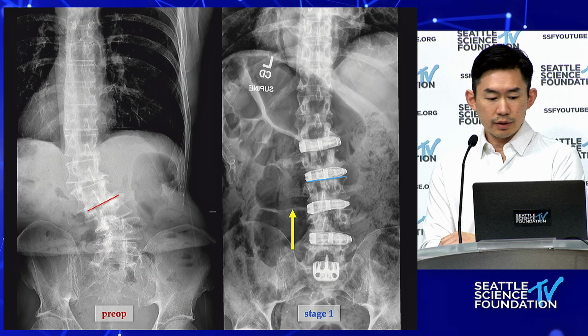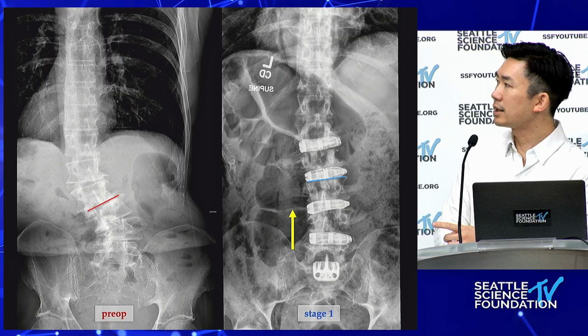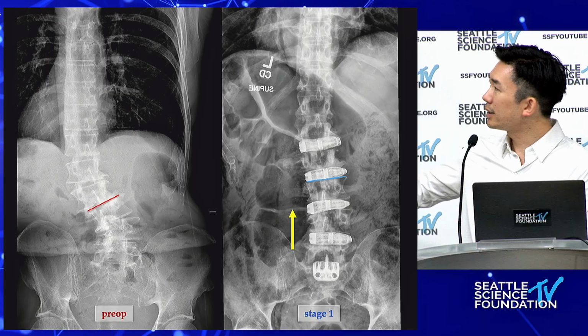I haven't used the coronal tapers, but I've had some inclinations toward it. Yeah, I guess in a way you could argue that this is also about type C or a primary lumbar curve. And I had the same concerns. And you'll see the bottom cages.